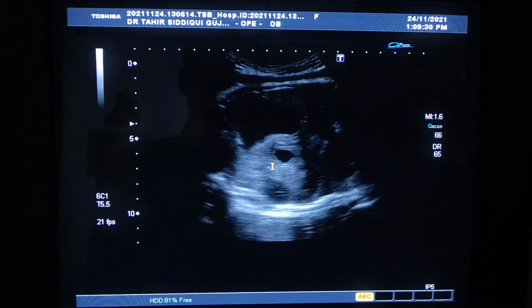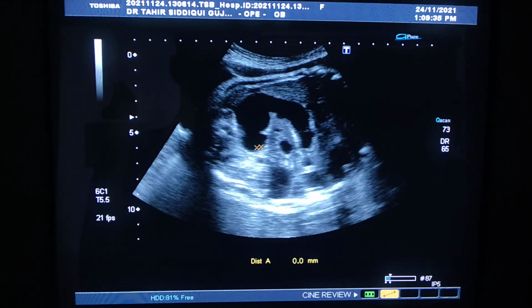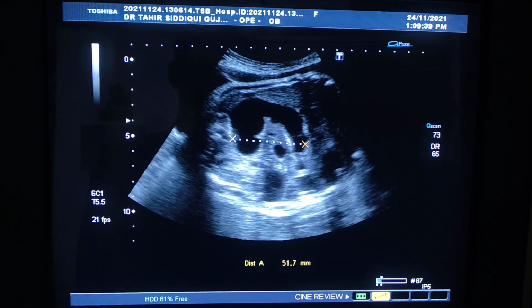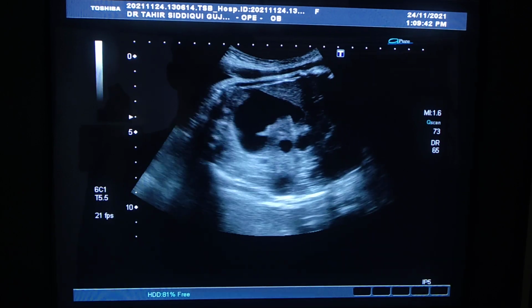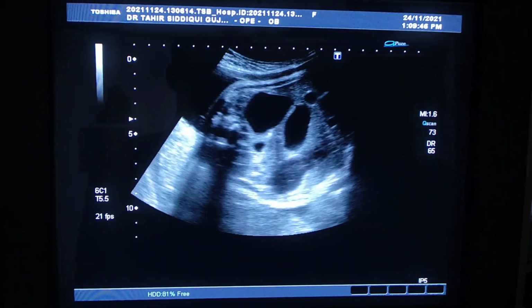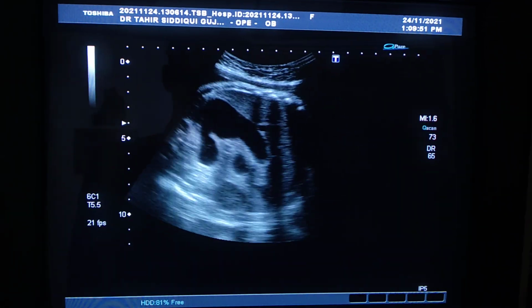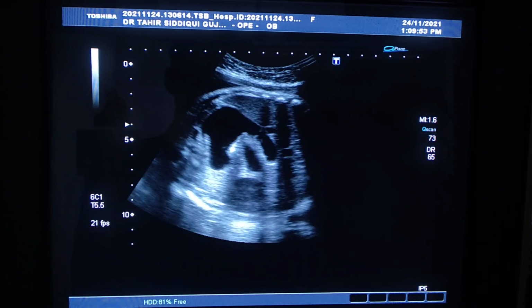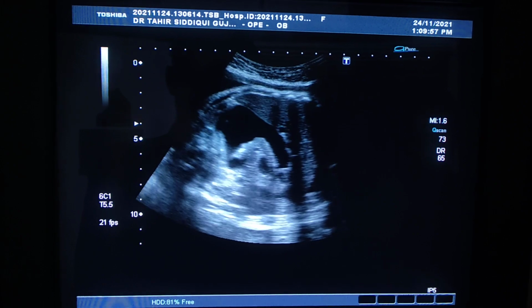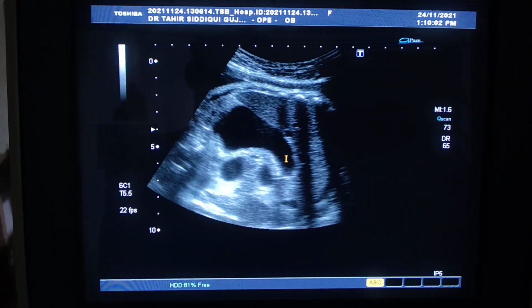They say even in the longitudinal section we should also measure any one segment, and let's measure this one. It's 51 and is significantly dilated. Now these cystic areas with internal movements within them are seen extending towards the lower abdomen from the upper abdomen.